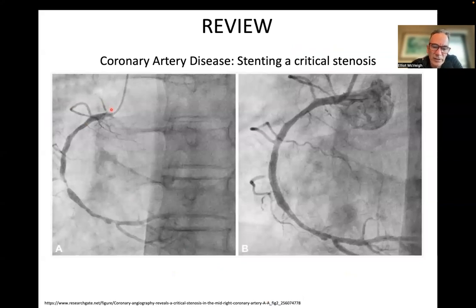So post intervention, the vessel looks great. This is why there was fantastic enthusiasm for this procedure, because you start out with a patient that looks like this, often called a very ratty vessel, in the sense it goes down to a 95% lesion, and then there's some thinning here, some thinning here, some thinning here. We've got all of these regions where obviously the vessel is full of lesions. And then post-procedure, this thing is wide open. You say, look at that stent there. You're saying, well, which would you rather have? If it was you, well, I'd rather have this.